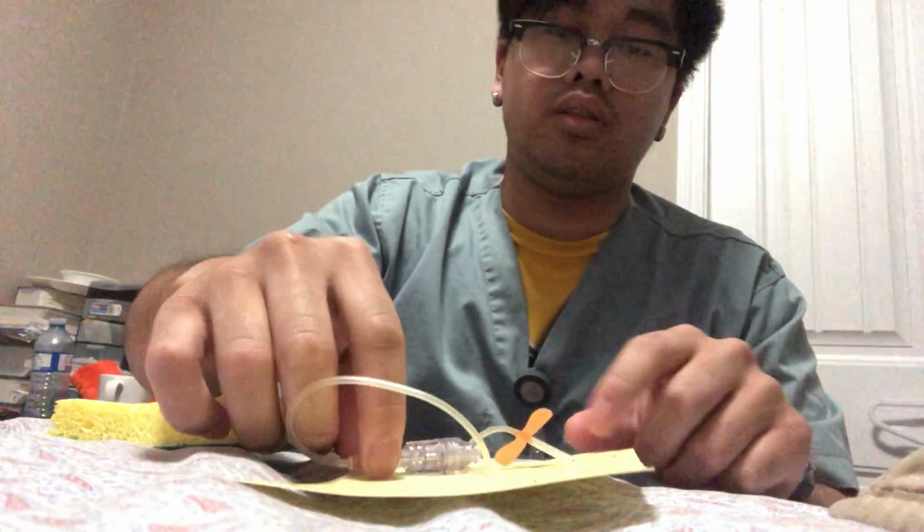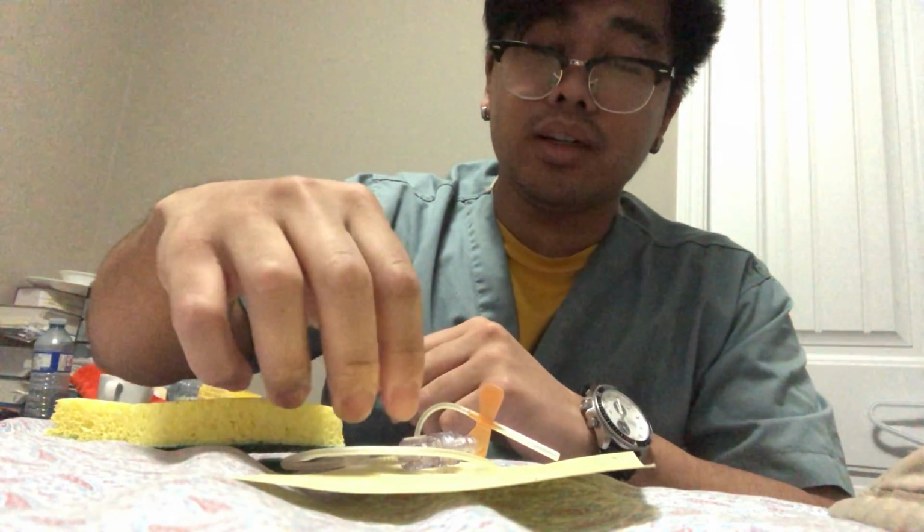So let's pretend this is the patient's skin, and I'll be inserting this to his abdomen. So the way that I do this is I'm gonna apply some hand hygiene and apply gloves, and I'm gonna take this needle right here and do the butterfly technique.